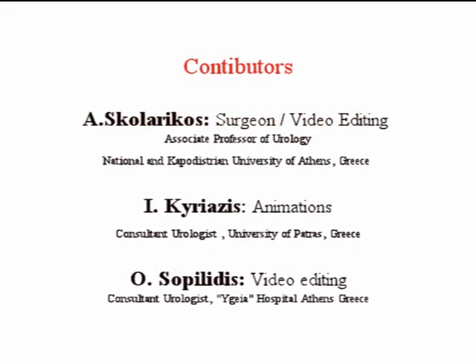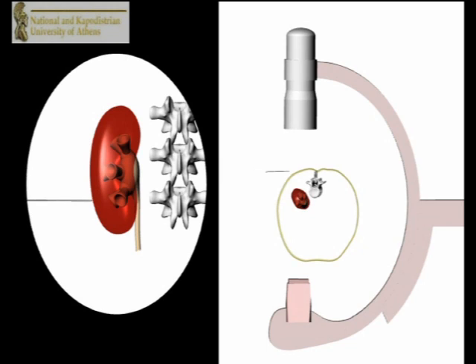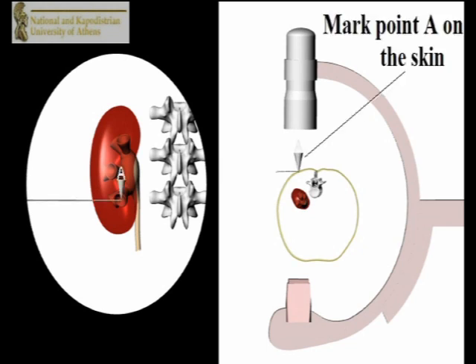In the triangulation technique, the C-arm is positioned over the patient in the vertical 90 degree position and the skin over the desired calyx is marked.